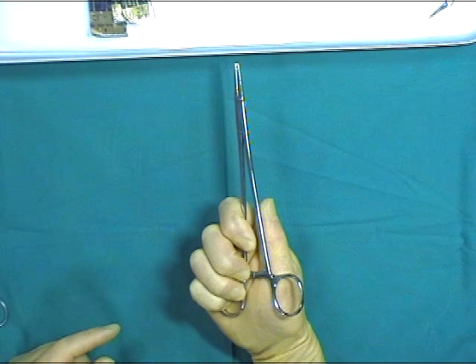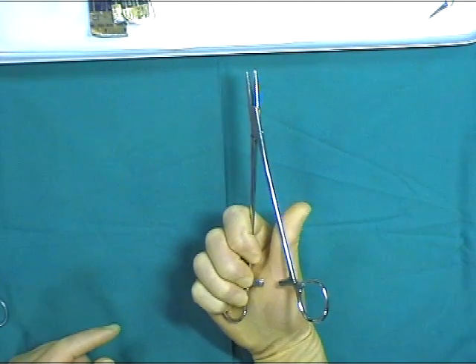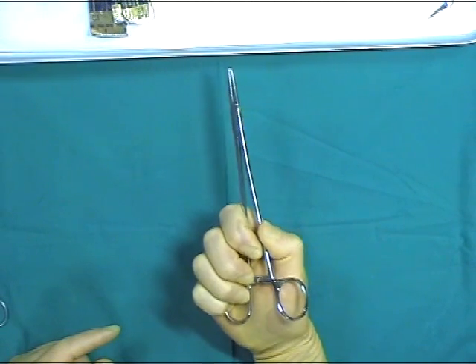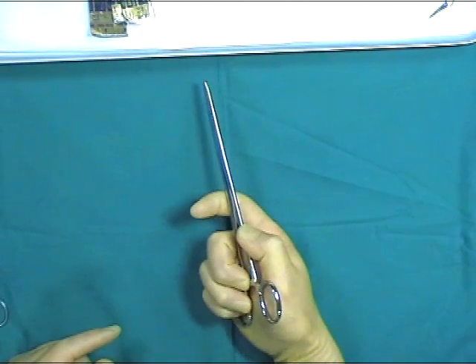Here we show an alternative technique used to grip the needle holder. This is the palm technique, where the thenar eminence is used to open the ratchet mechanism. It is important to try to keep the index finger down the shaft of the needle holder to maintain stability.